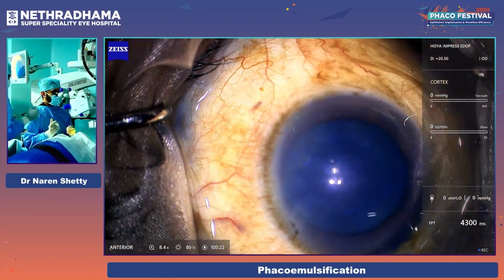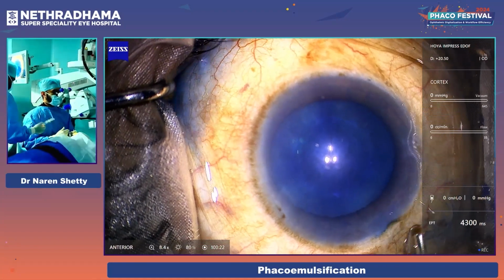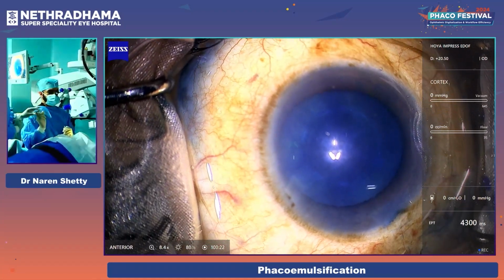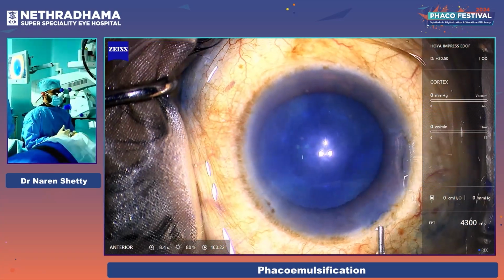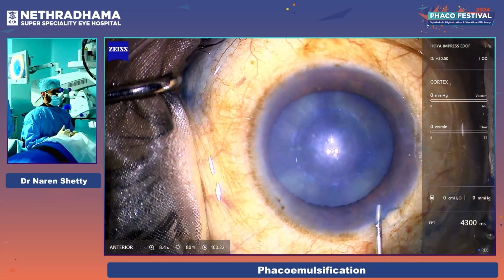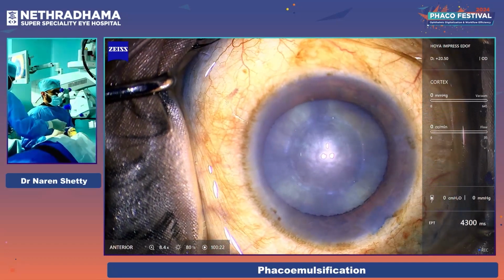Look at the light here, sir. Adrenaline and Ocucoat, please. Not visco, adrenaline, please. And Ocucoat, please. Ocucoat. Okay.